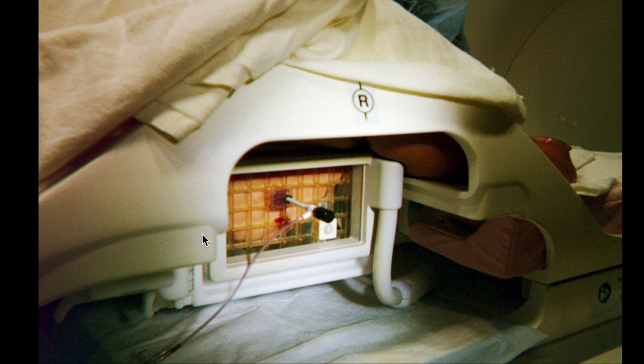So this is where she is. I'm putting her back inside, taking an image to make sure that I'm in the right place. This is the biopsy device here. This is the machine that controls the biopsy device. There is actually another 10 cc's of lidocaine with epi connected to this machine, so that when the biopsy is being done, this medicine is going in at the same time.